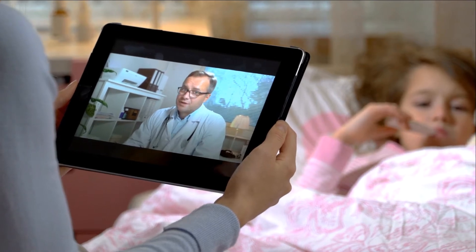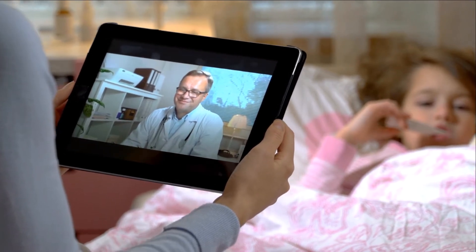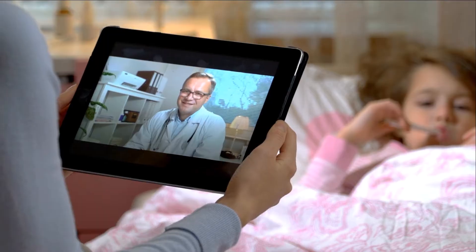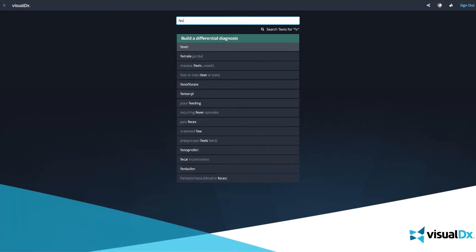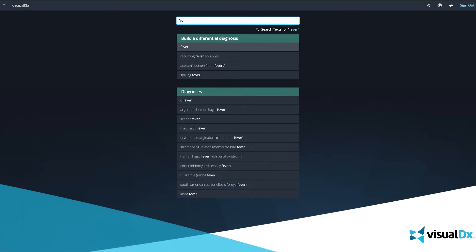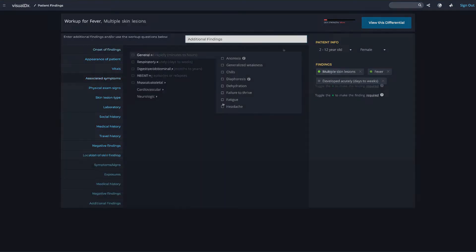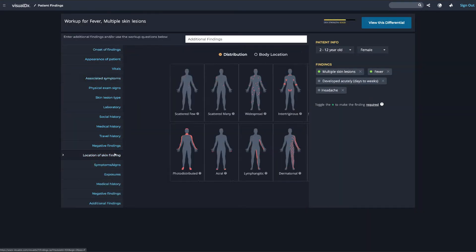During a live telemedicine visit, use VisualDx just as you would during a clinic visit. Start with a chief complaint, then follow the guided workup to add symptoms and findings to arrive at a personalized differential diagnosis for your patient.